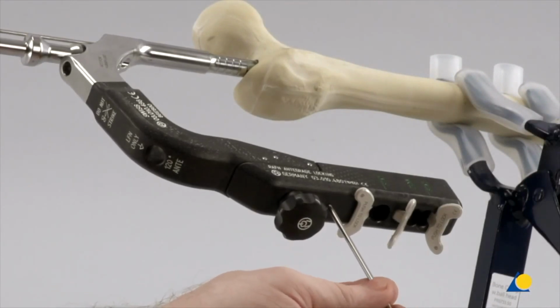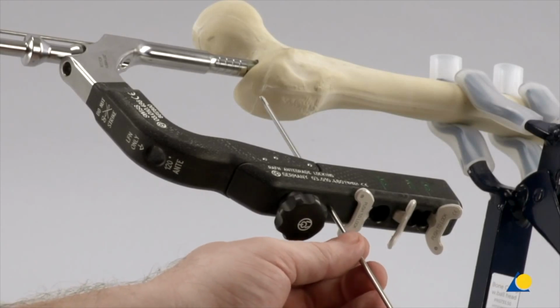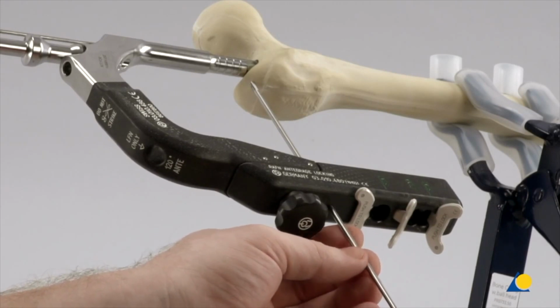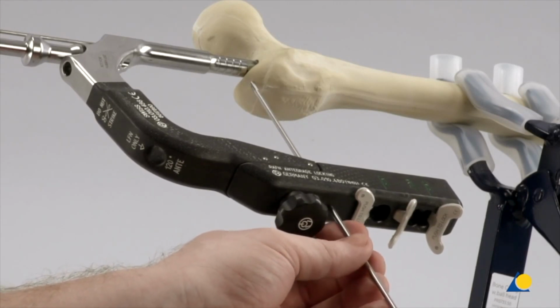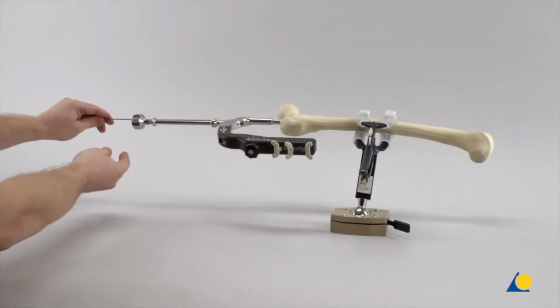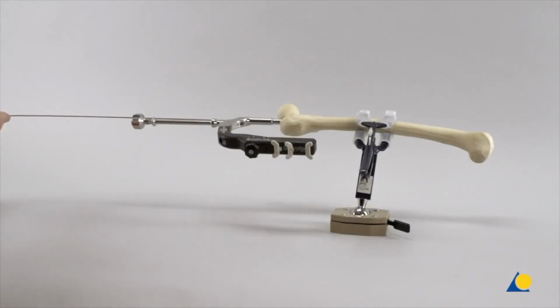This can be verified by inserting a guide wire through the hole marked nail end on the aiming arm. The nail insertion depth can be adjusted by manipulating the nail to the appropriate depth as indicated by the grooves on the insertion handle. The guide wire and reaming rod are removed.